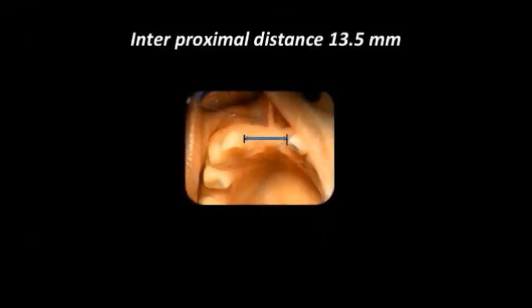And then the second step, we have to measure the interproximal distance. It was about 13.5 millimeter.